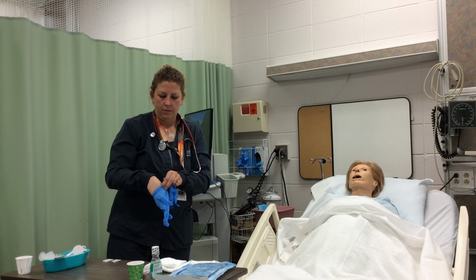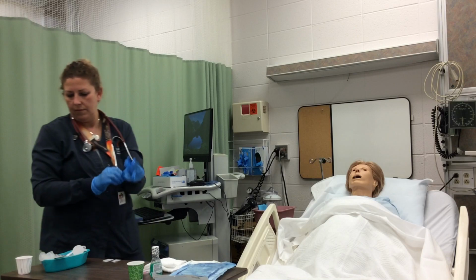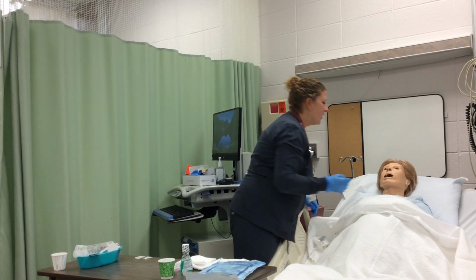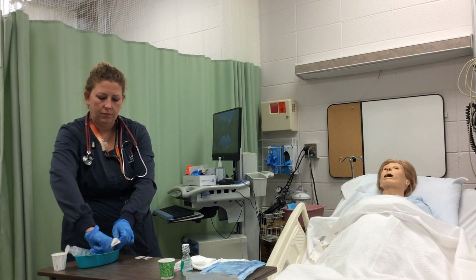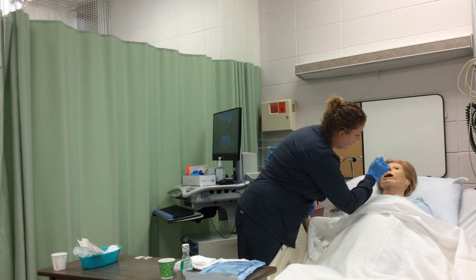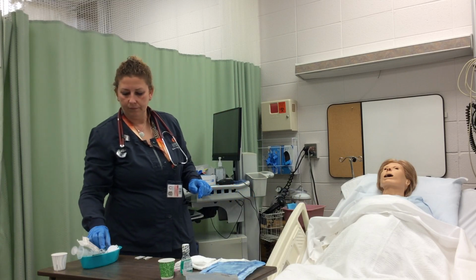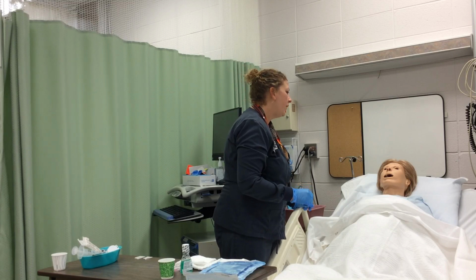And Sarah's putting on some clean gloves before touching the patient. Open your mouth real wide. Gag reflex is present. Using a pen light, inspect the condition of the patient's nares and nasal and oral cavities. Determine which nostril is most patent and use that side if able. Ask the patient about history of nasal surgery or congestion or allergies, and note if deviated septum is present. No deviated septum is present.